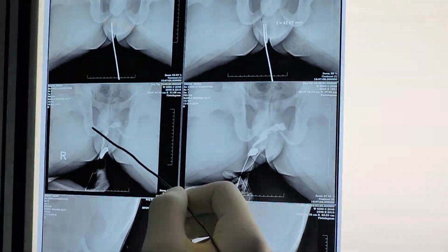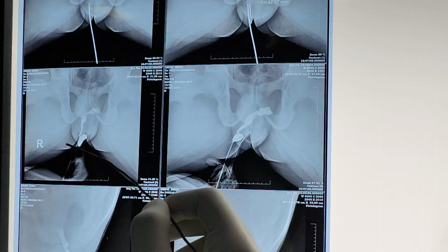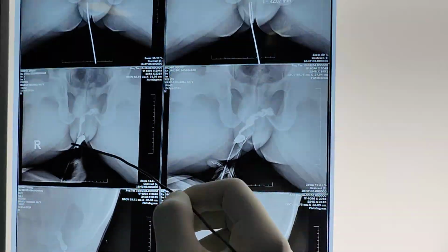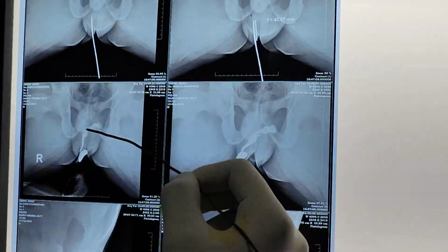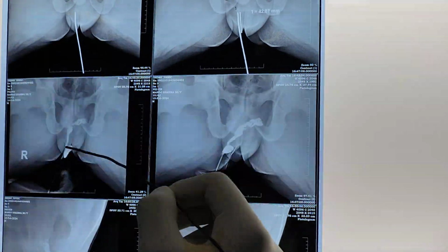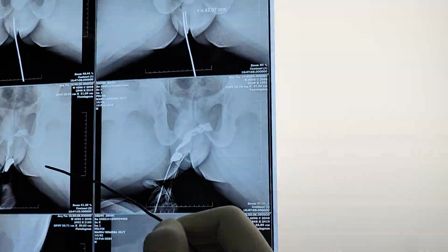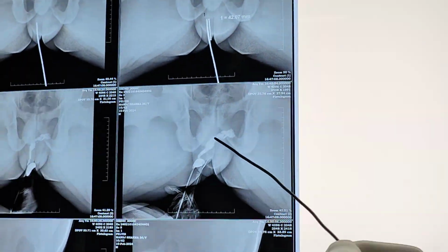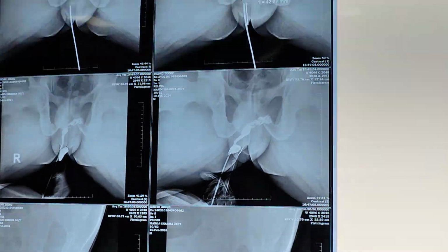This is the Urografin 75 which is injected from the external opening of the catheter, and you can see there is a tract. There is a curvilinear fibrosed tract, you can clearly see, and it attains a half horseshoe shaped fistula. So again, with this picture you can clearly see the presentation, and it is very interesting in the lateral view.